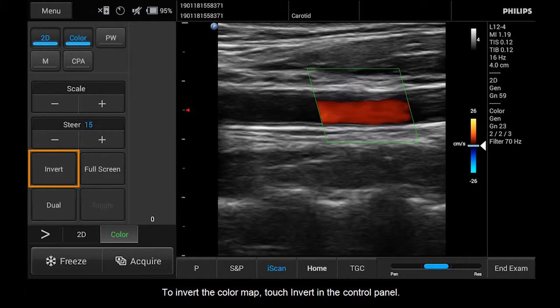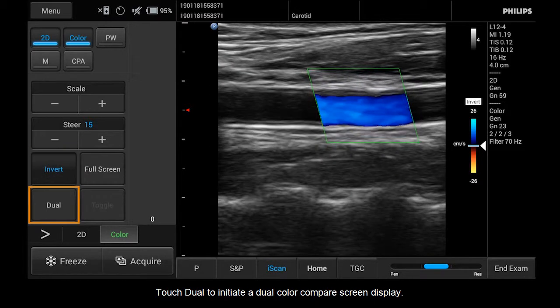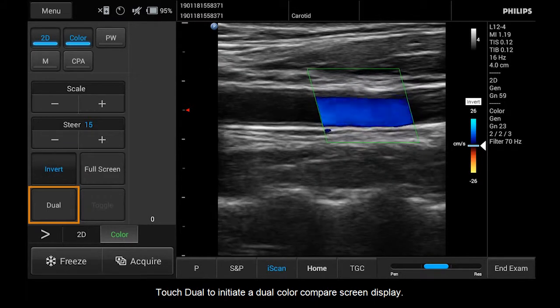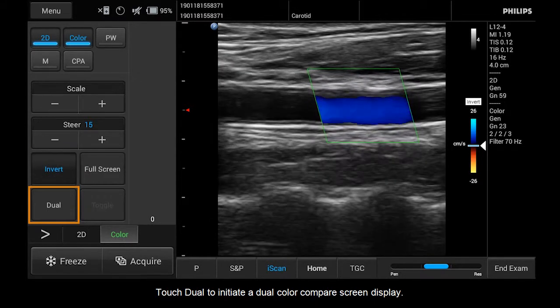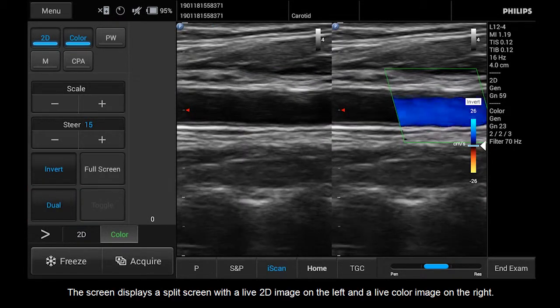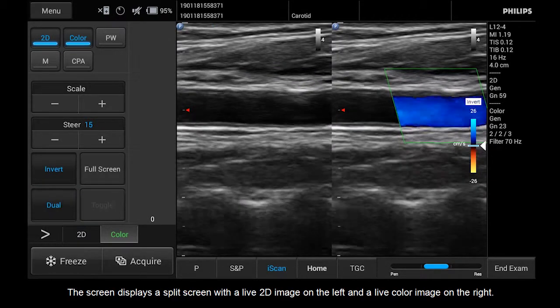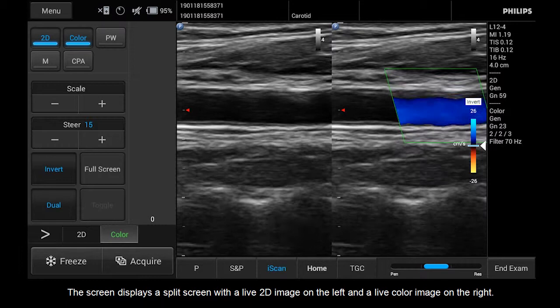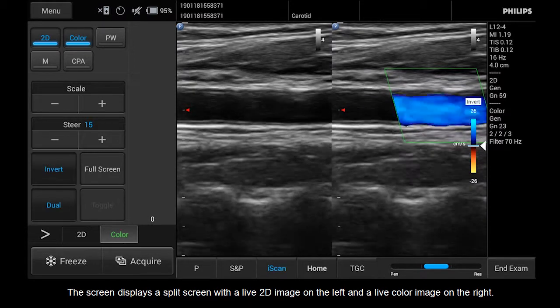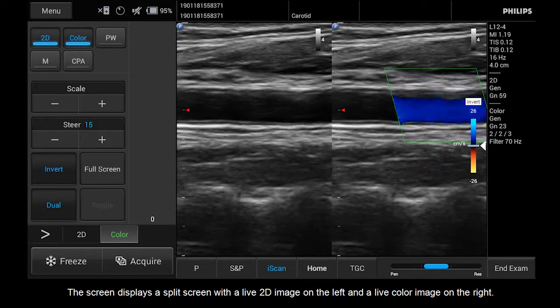To invert the color map, touch Invert in the Control Panel. Touch Dual to initiate a dual color compare screen display. The screen displays a split screen with a live 2D image on the left and a live color image on the right.